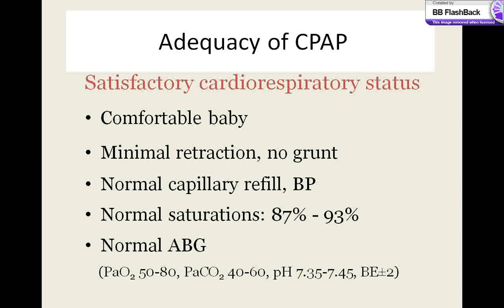Once baby is on CPAP, we expect baby to settle down. Respiratory distress, the main indication for which baby is on CPAP, should decrease. Silverman score should read less than before. Grunt should disappear. Along with improvement in respiratory status, hemodynamic status will also improve. Heart rate, capillary refill, and blood pressure should also improve.